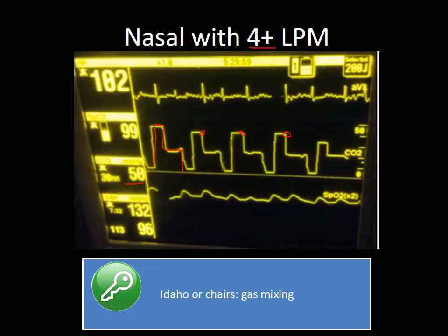In the end, it didn't really change anything because the end tidal still detected at the top wave rather than here. So I was still getting the reading. If I wanted to check, all I have to do is just turn off my oxygen for a second, and then it goes back, and then I can crank them back up.